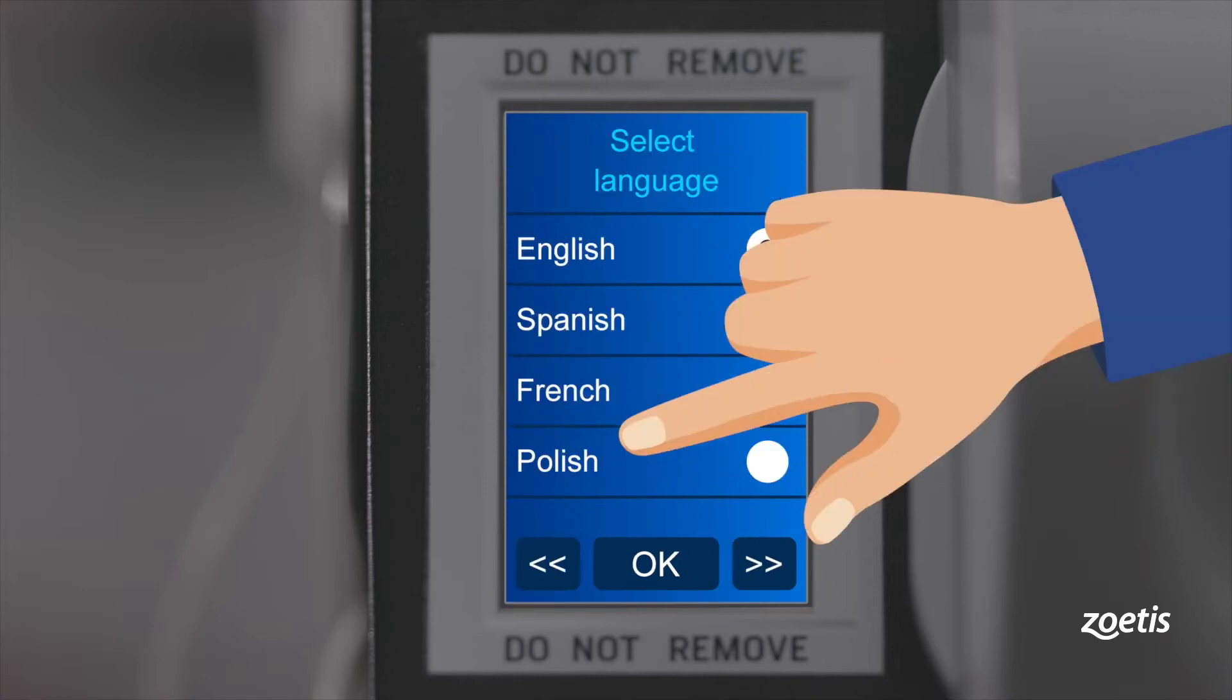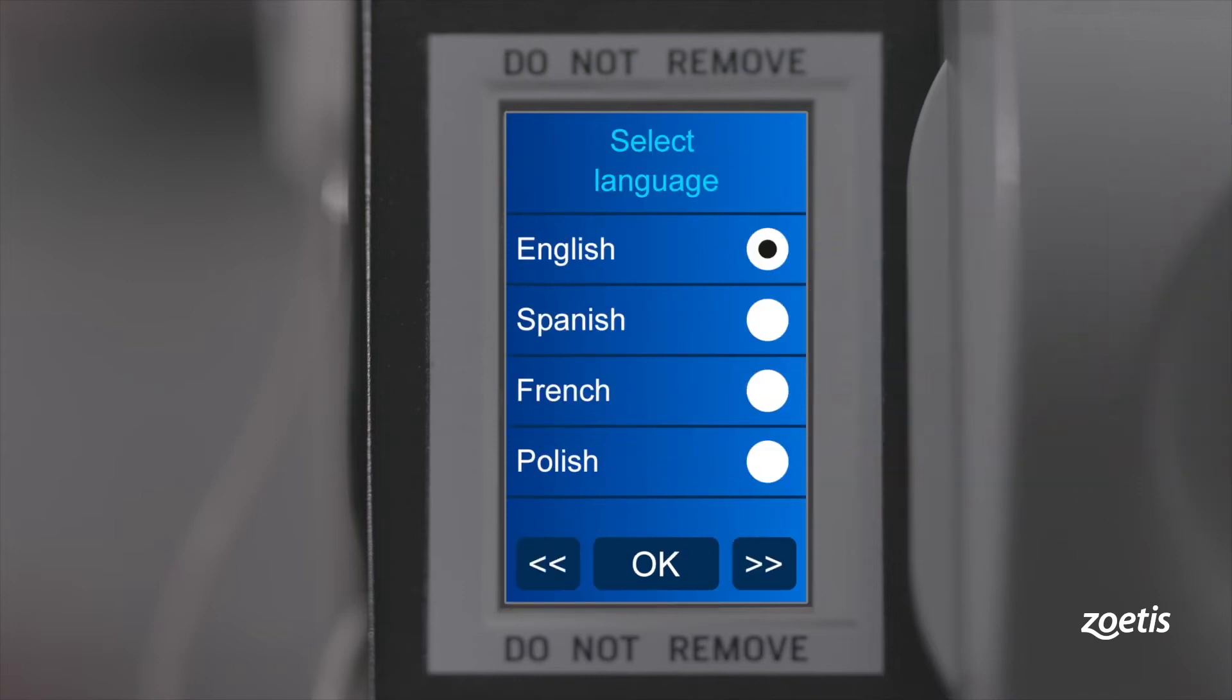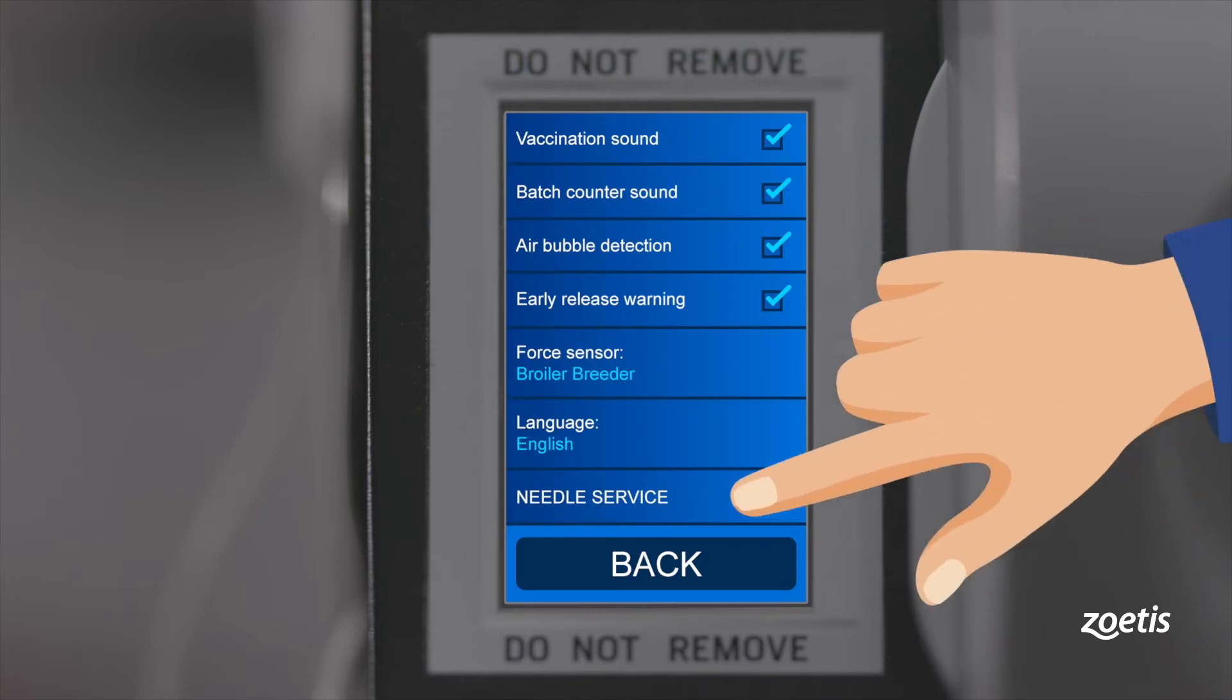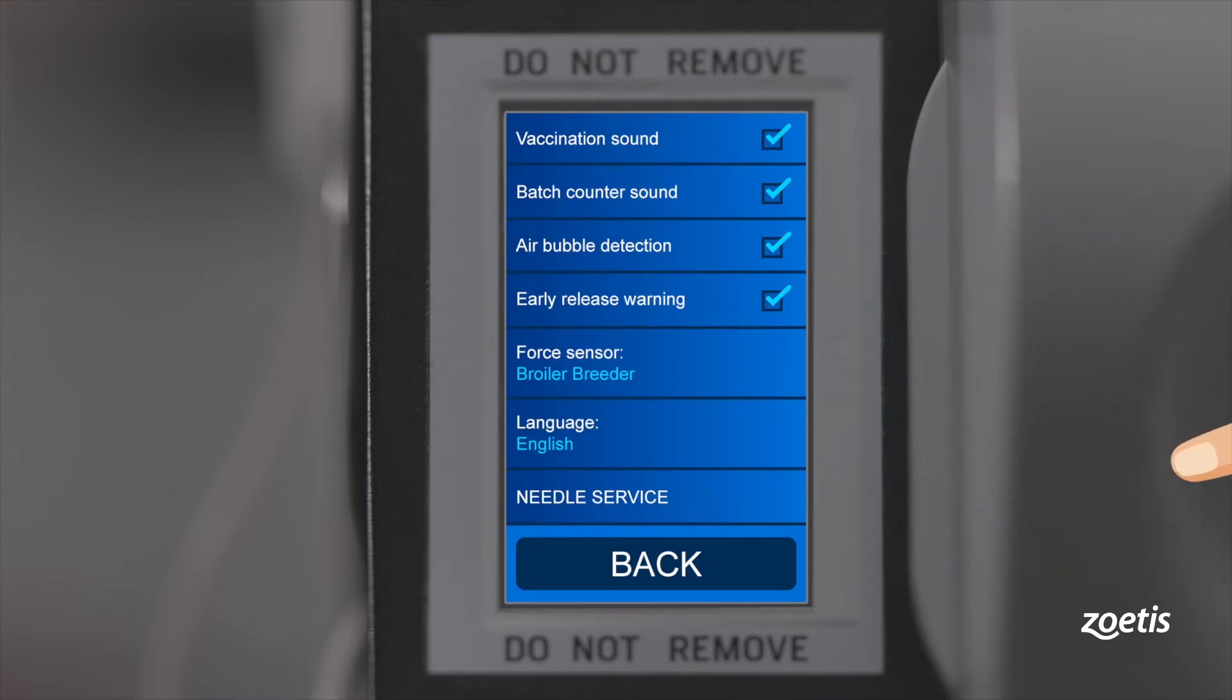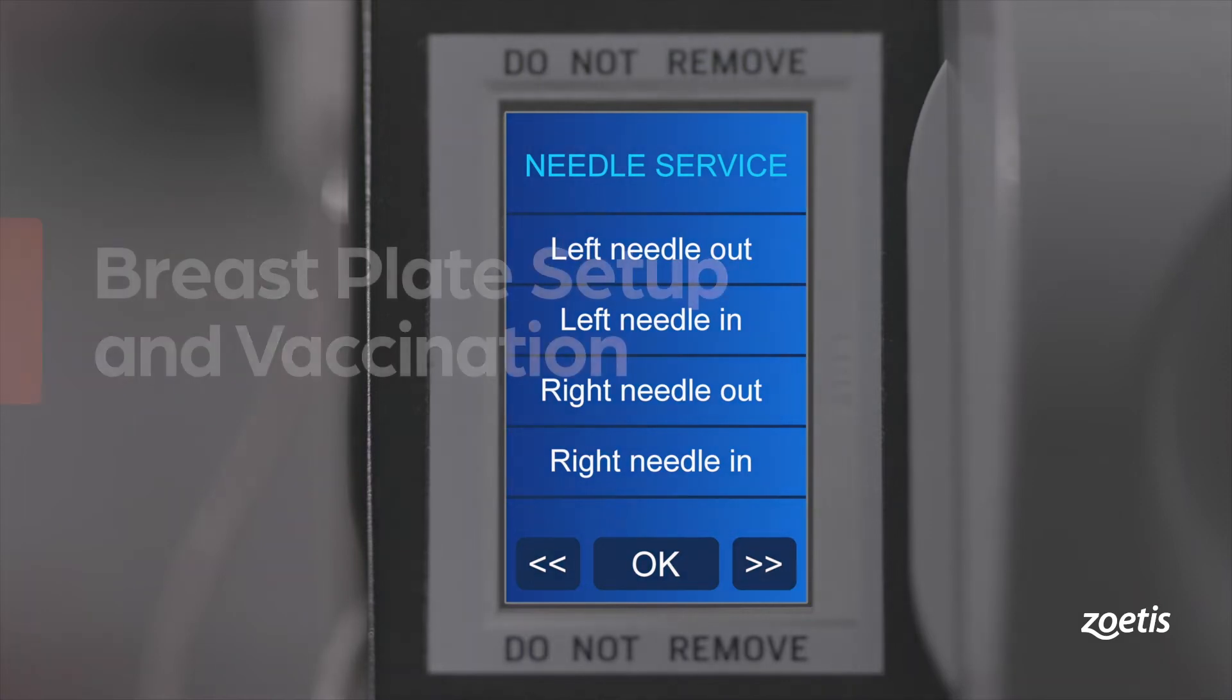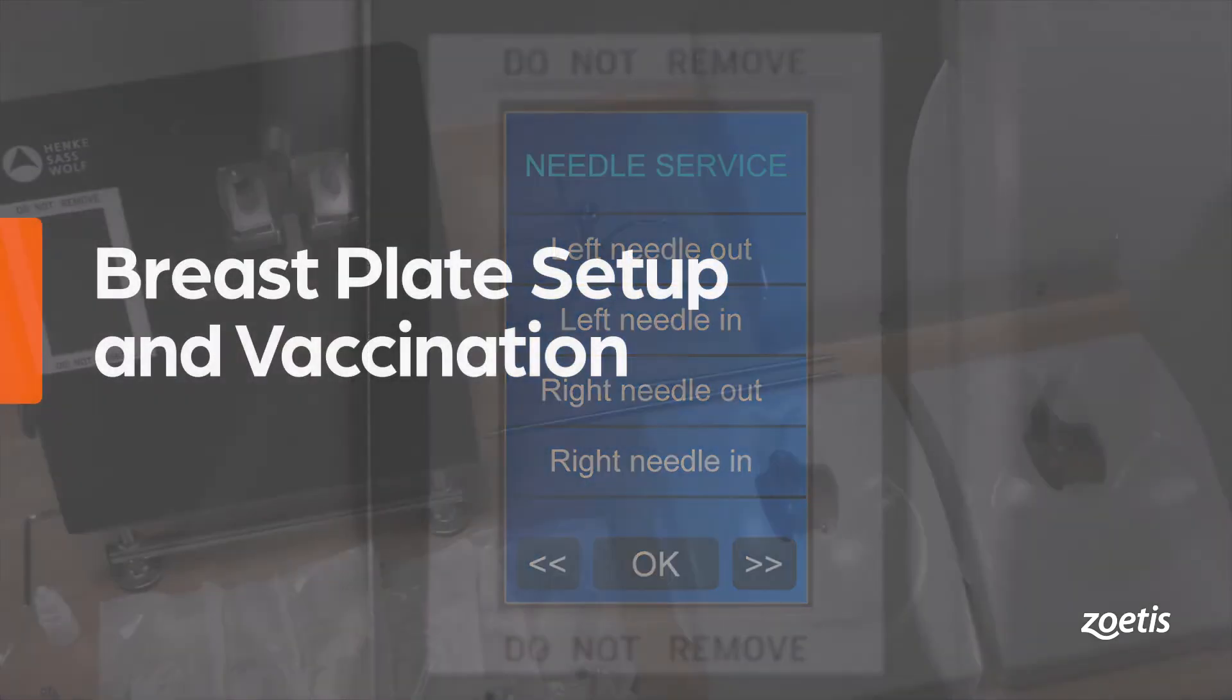Language: you can choose between various languages. Needle service: use this function to exchange the needle during operation. This service is only available after the first injection.